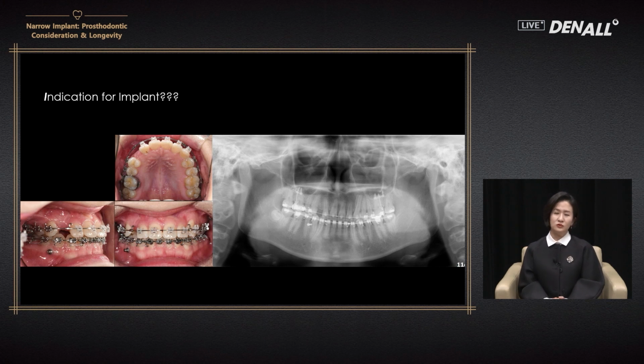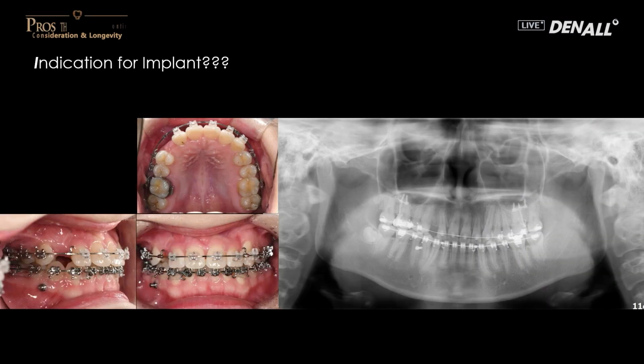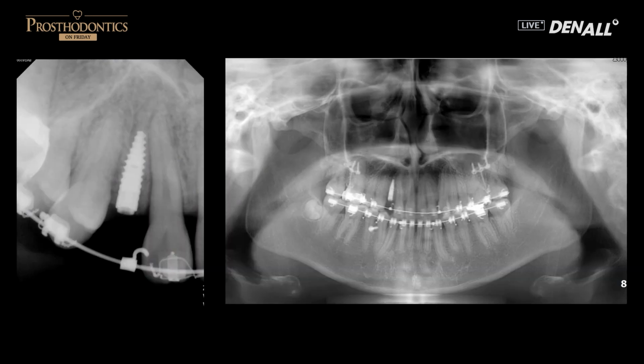Ortho patients like this, on the labial side, dehiscence can be a concern in narrow bone cases. The cervical mesiodistal width looks sufficient, but at the root, due to the directional difficulties, placing an implant can be a challenge. However, a 2.9 millimeter diameter implant can be used for this kind of restoration.